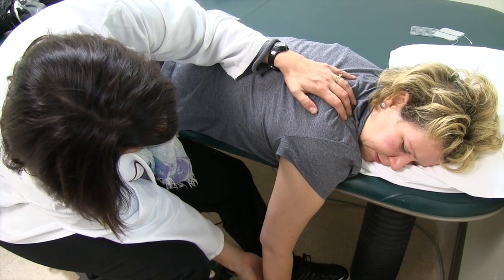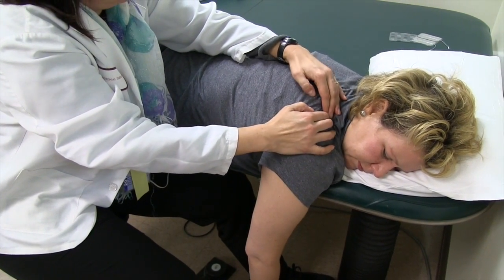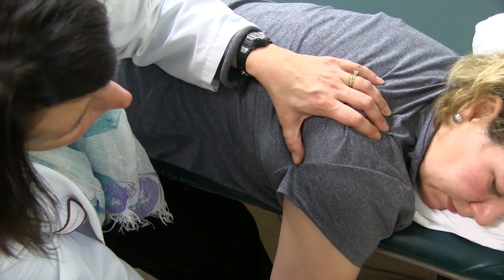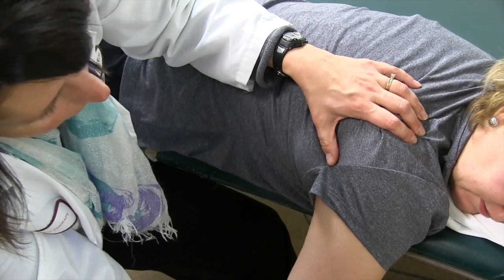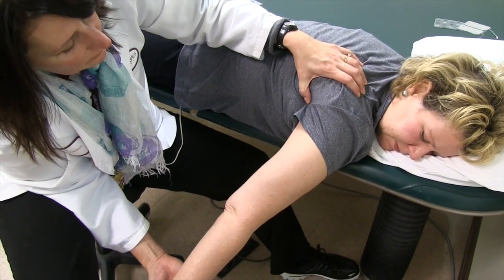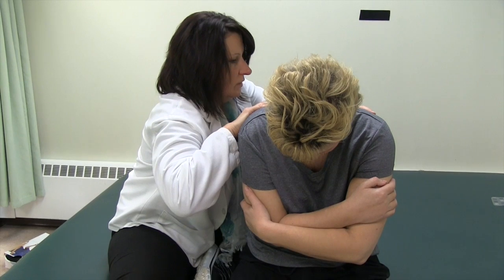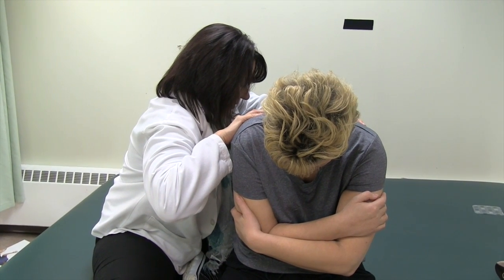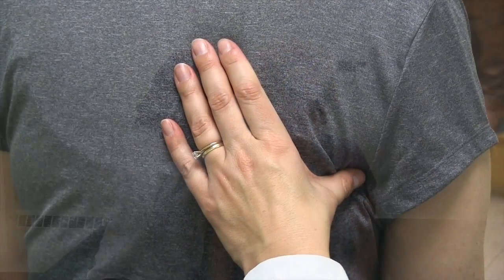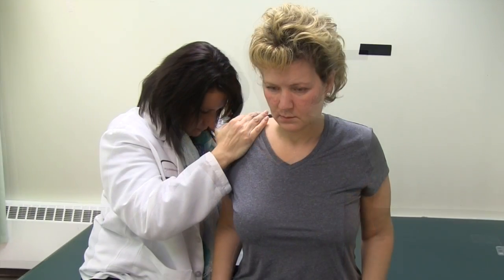The stim is on and now it's off. On. Good — work with me, pull it up. Pulling that shoulder blade down and back. Stretch out this muscle back here. Pull him back. Nice and tall — get that good posture, this lower curve in your lower back. Pull it up.